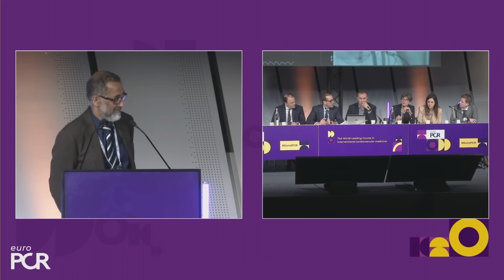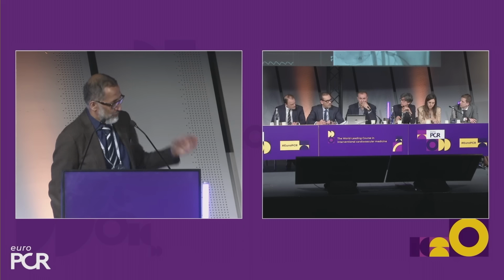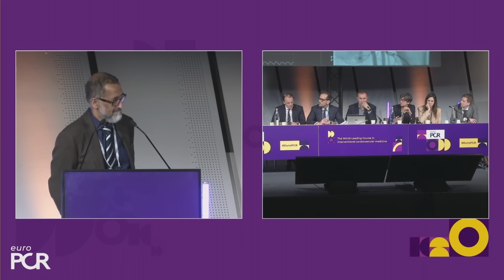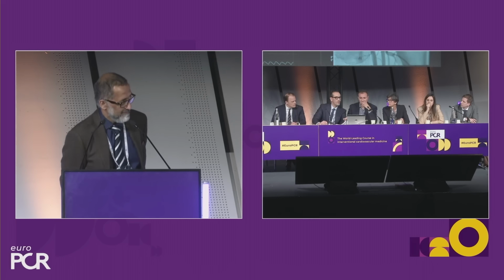So to summarize, you select the balloon size according to the minimum diameter, because there is not so much calcium in the valve and in the annulus. That's correct? Yeah. Maybe let's have a small discussion about that. You have a question, Simon?